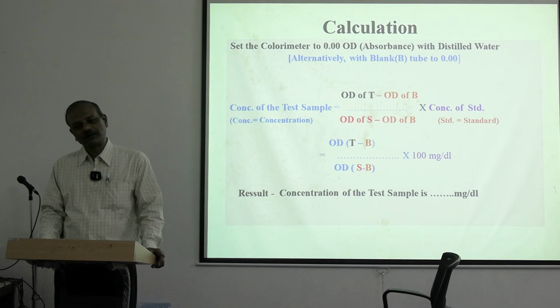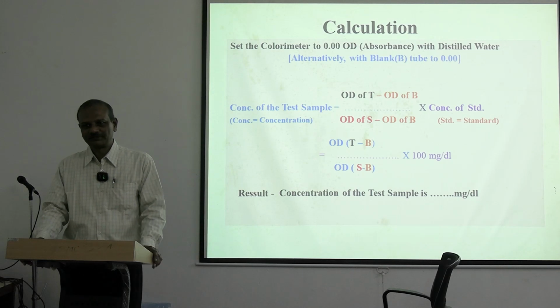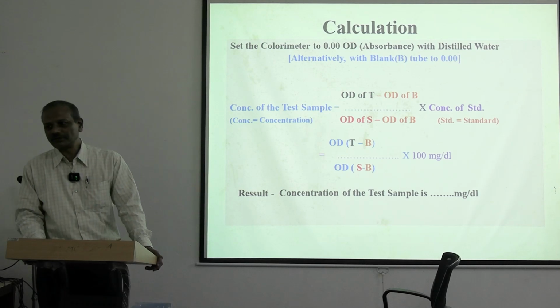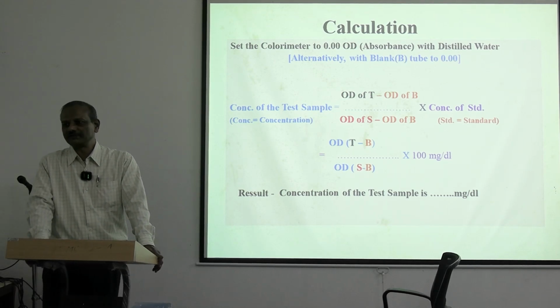Spend 1 hour, I will take the class, and thereafter you can go home. So 1 day of extra staying will be required. Or I can come in the evening also, if you so wish. So this is the actual procedure of plasma glucose estimation, and you will do it next time in the laboratory.